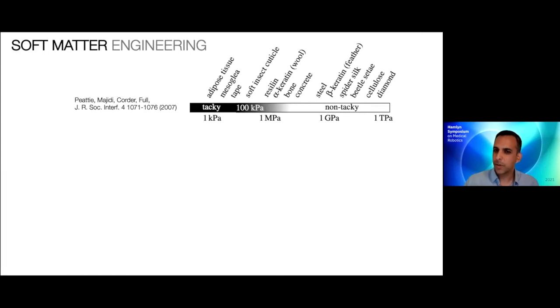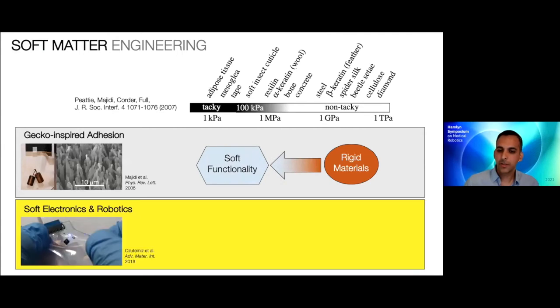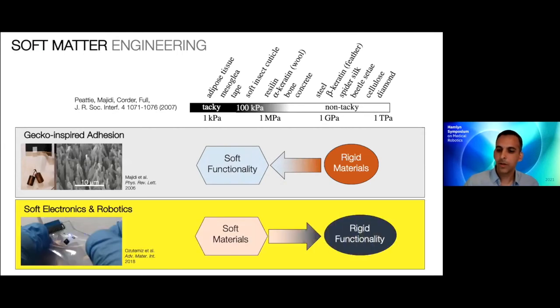I think Ravinder did a really nice job of motivating why we're interested in soft materials and soft robotics, so I won't spend too much time on this slide. From my perspective, the goal here is to engineer machines and electronics for robotic systems using materials that are orders of magnitude softer than what we've traditionally used in engineering. So instead of hard metals and plastics and ceramics, we're working with soft gels, elastomers, and fluids that have mechanical properties in terms of their deformability or stiffness much more similar to soft biological tissue.